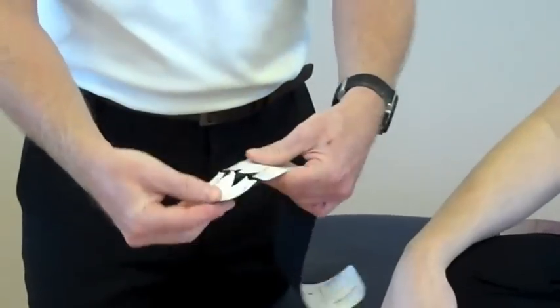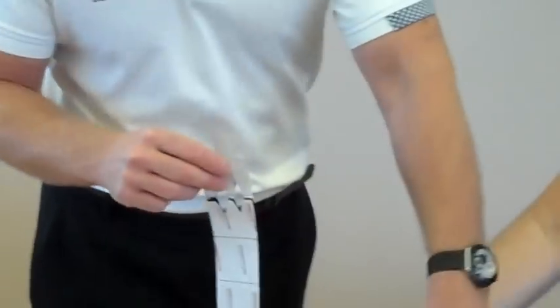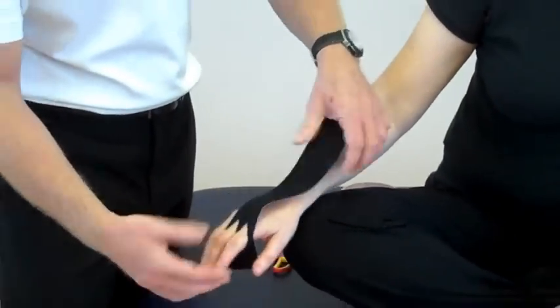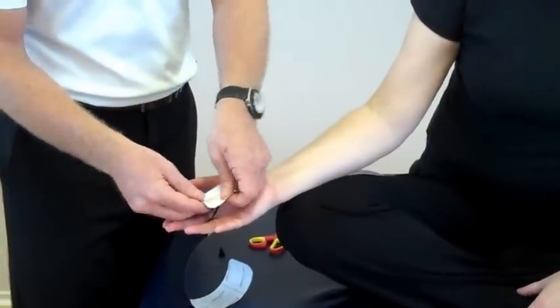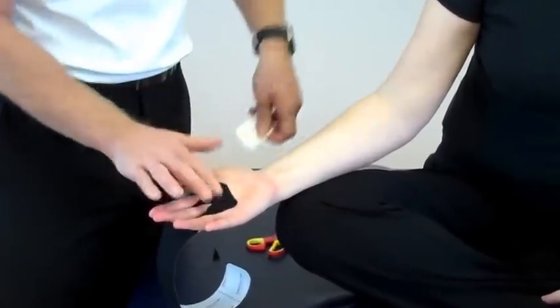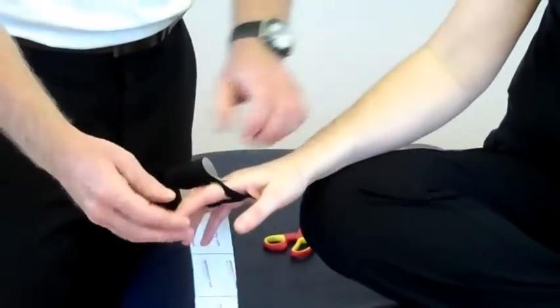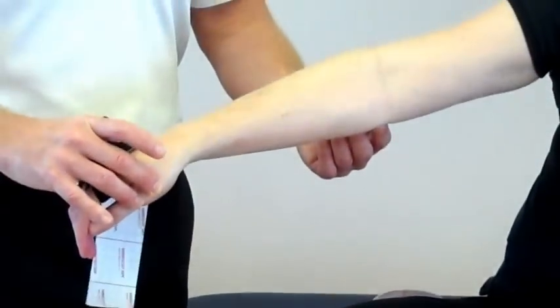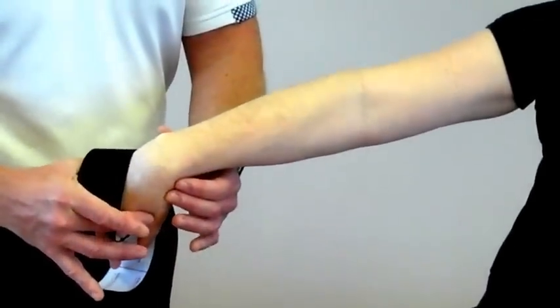What we're going to do now is place the index finger and the middle finger through there. Turn your hand that way. Peel back this tape and feed it out onto the palm. Obviously the palm is very sweaty so it's not going to stick that well, so maybe use some spray. Now we're going to preload the tissue — elbow is straight, wrist is flexed, and then we're going to pronate.